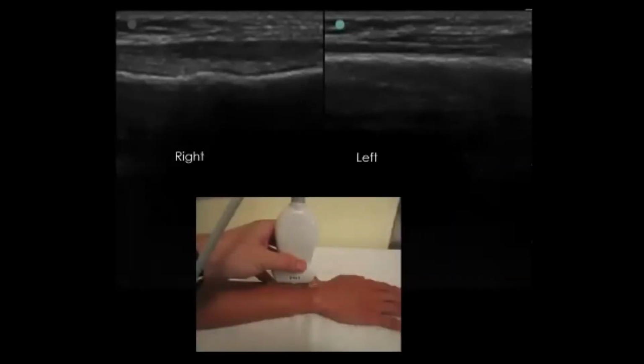So sometimes the fractures are pretty easy to see. But sometimes they can be quite subtle. So in this case, we have a pediatric, actually, I think this might be an adult forearm. I can't remember from looking at it, but on the left side, this is a distal radius and it looks pretty good, but you'll notice on the right side that there is simply a cortical irregularity. And again, it's great to have a contralateral normal to compare your findings to. So this is actually a little bit of a buckle fracture or just a slight hairline fracture, but it's definitely different, and the patient has swelling and pain there. So I would be pretty comfortable calling that.